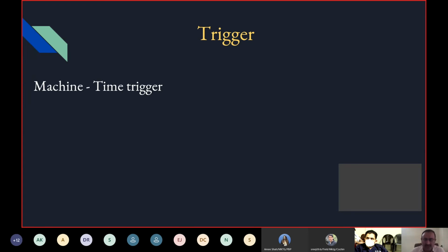In those 5 seconds, if you are setting an IE ratio of 1:2, it's around 1.6 and 3.2 for inspiration and expiration. So the machine is being told that every 5 seconds you have to give a breath. The machine is the trigger. The machine does it depending upon the time. Time is being given to the machine, and the machine gives the breath.